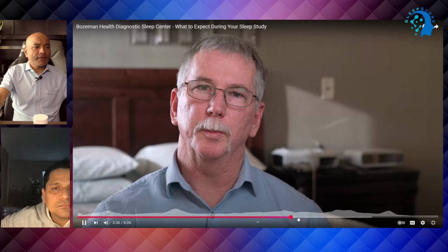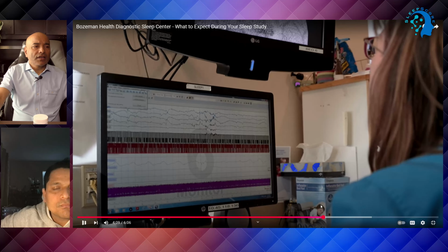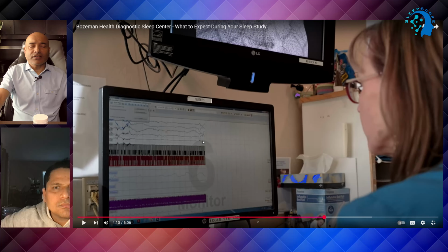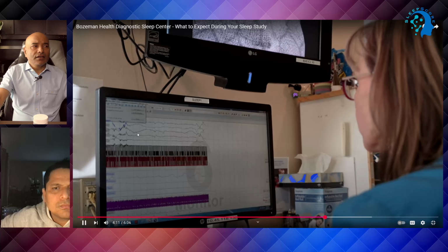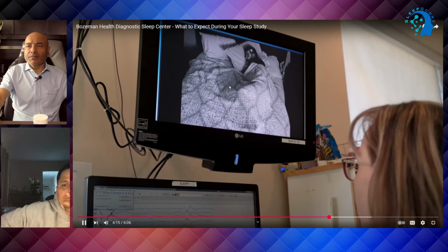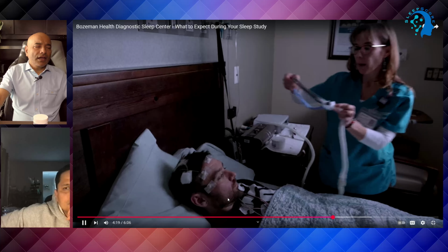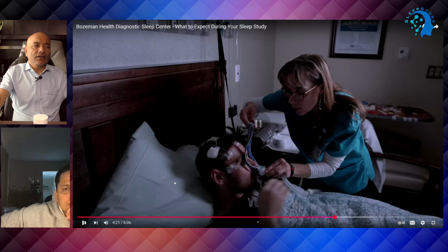You are encouraged to sleep in whatever position you naturally do. Occasionally, the technician will go and monitor as the night progresses. You see, during the night, the sleep technologist will monitor the patient sleeping. There's a video and information from the electrodes. You can see it there. Depending on the results we begin to see, you may be awakened during the night.